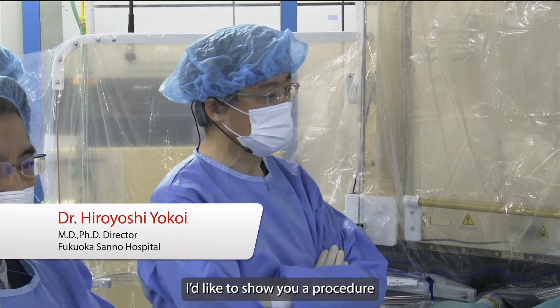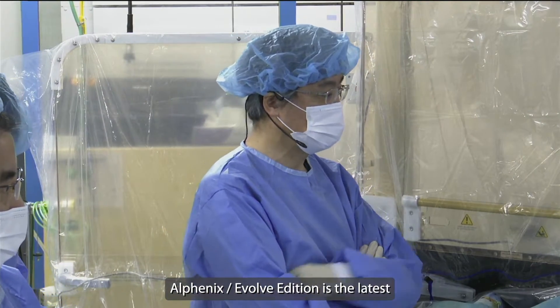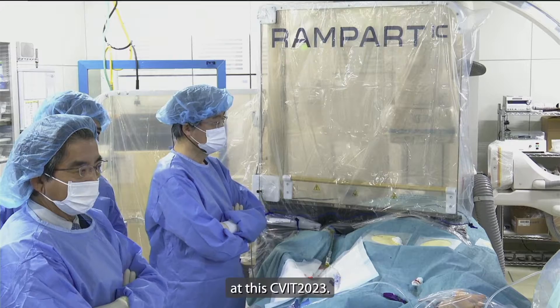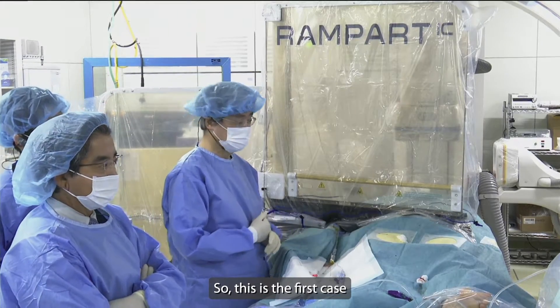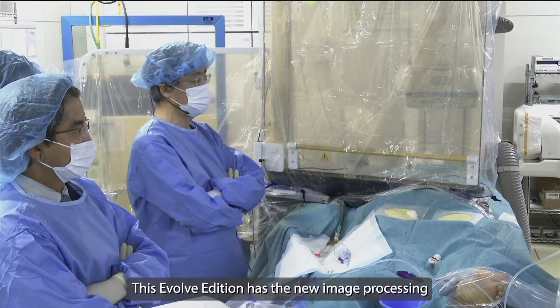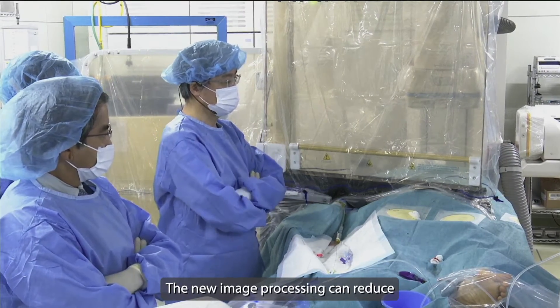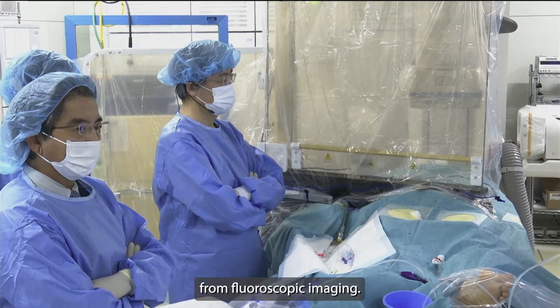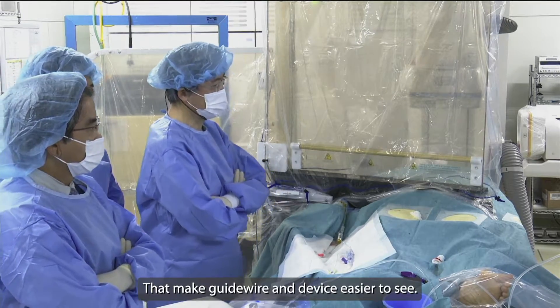I'd like to show you a procedure using the Alphenix Evolive Edition. Alphenix Evolive Edition is the latest angiography system released by Canon at RSNA 2023. This is the first case using the new Alphenix Evolive Edition. This Evolive Edition has a new image processing based on deep learning. The new image processing can reduce noise from fluoroscopic imaging, providing high contrast and clear images that make guide wire and device easier to see.